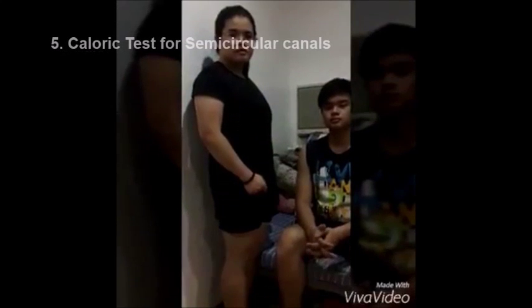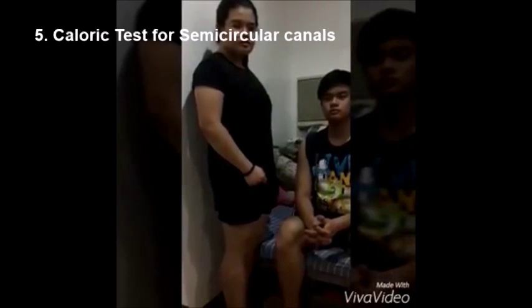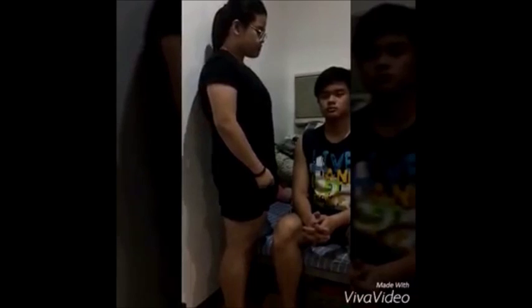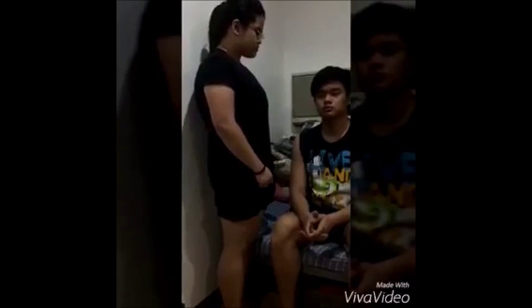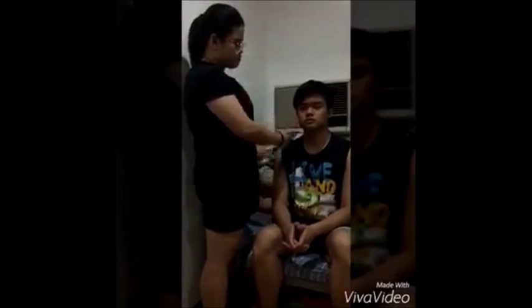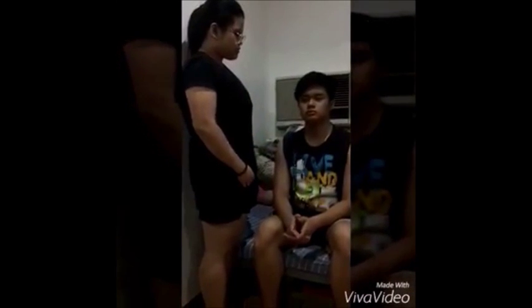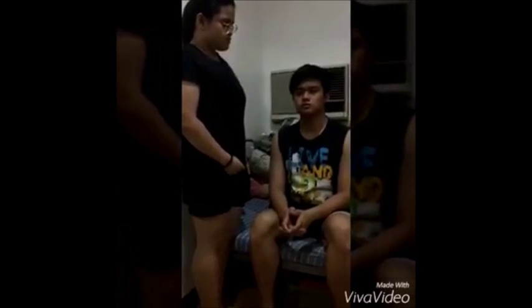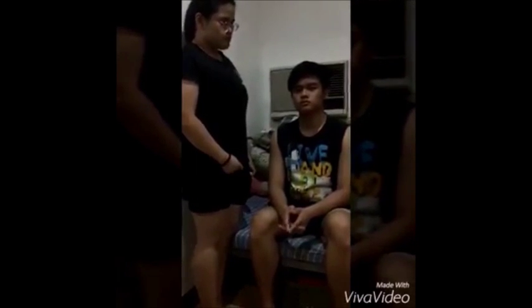Caloric test. The examiner alternately applies hot and cold test tubes several times just behind the patient's ear on the side of the head. Each side is done in turn. For application of cold tubes, the direction of the nystagmus is opposite of the tested ear. For the application of hot tubes, the direction of the nystagmus is the same as the tested ear. A test is considered positive if there is a presence of nystagmus and vertigo.